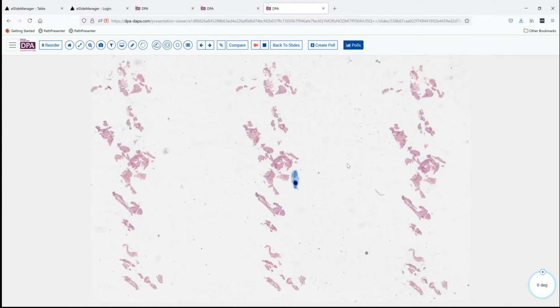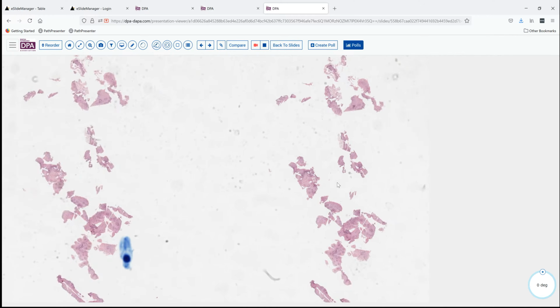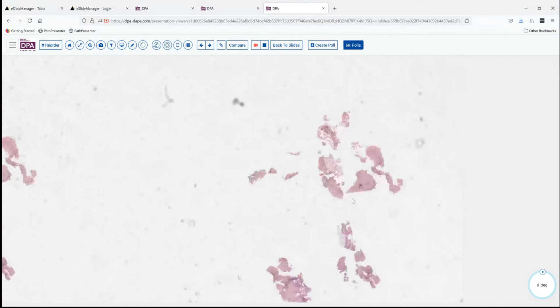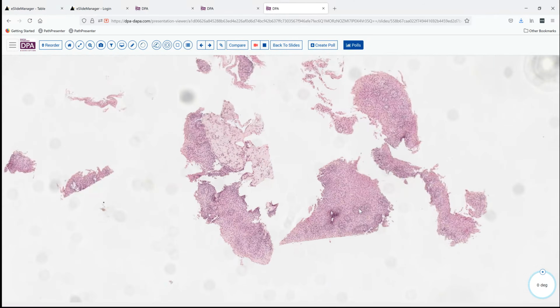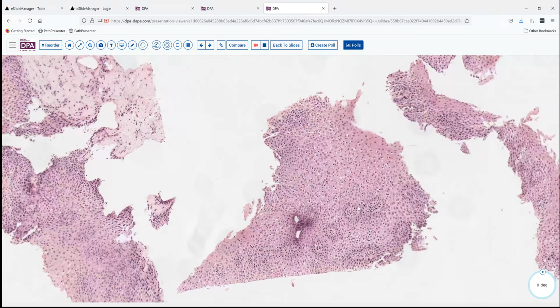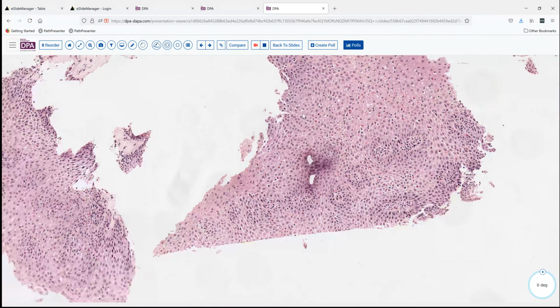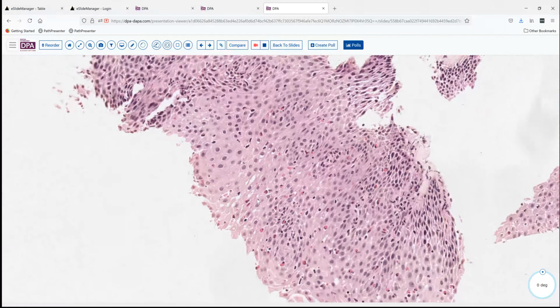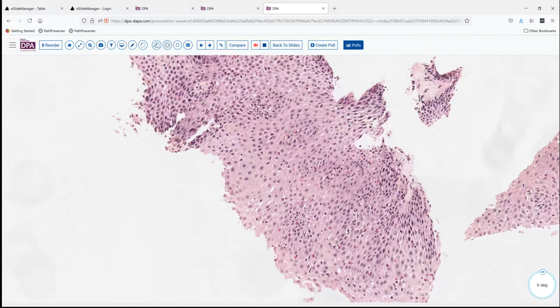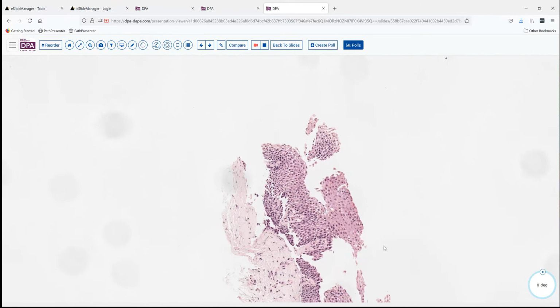So one of the clues in evaluating GI biopsies is, of course, to examine all the fragments. So here's a patient with symptoms of GERD or reflux disease. And in fact, we can see that there's an abundance of eosinophils, edema, a few scattered lymphocytes in this squamous mucosa. So clearly it's very actively inflamed, and a lot of eosinophils. And if it's not GERD, it's eosinophilic esophagitis, depending on where we're from.